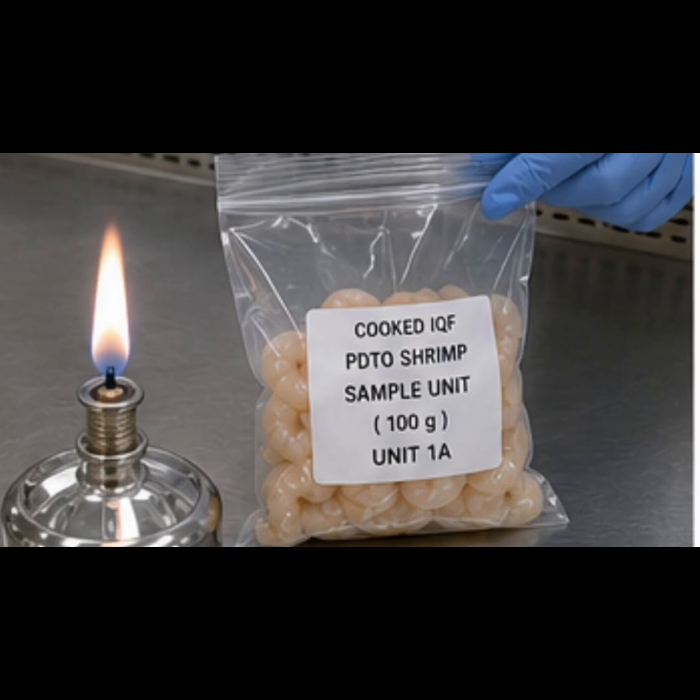Each sampling unit should be a minimum of 100 grams. Why a minimum of 100 grams? Because we have to collect a larger sampling quantity. That means 3 kg of material from a lot code we have to collect randomly.